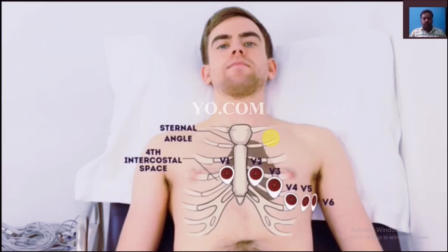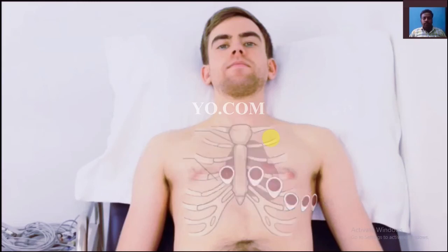So refer to the previous lead system video. Based on that, they are connecting the leads.